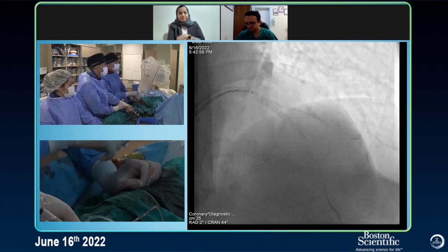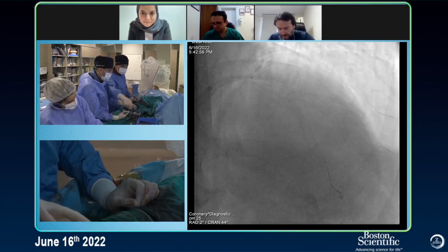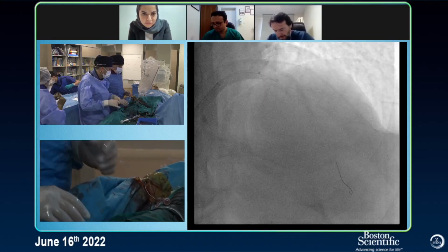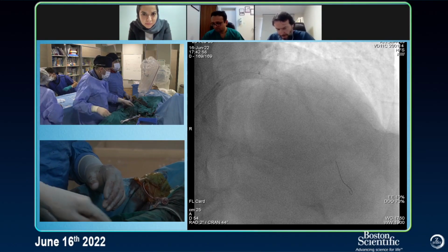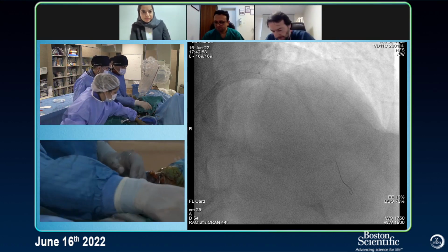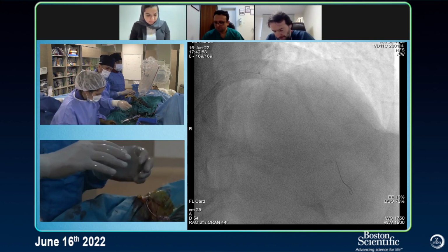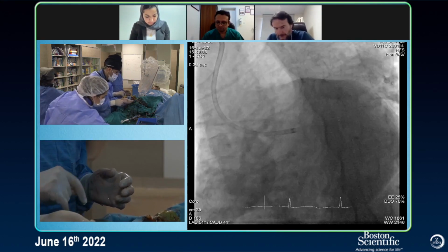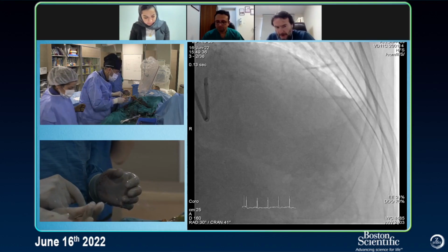I have LAD. Yes, LAD is not a problem. It is difficult. No rush. Or I still have a chance to go maybe crush. You know, I have a wire in place. Fine, use it.